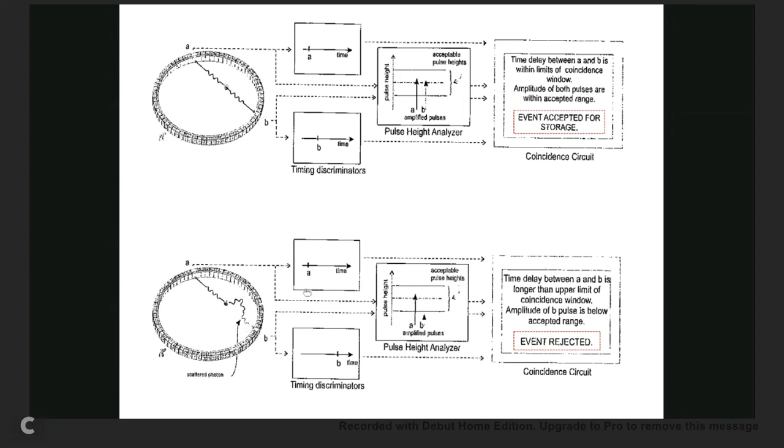Okay, so A is obviously recording the time, and B is recording the time here. Right? But now go to your pulse analyzer, and A is going to be accepted because it falls within the coincidence window timing that you set, which was already set between 5 to 15 nanoseconds. And B falls well below that, so B is going to be rejected. Okay?